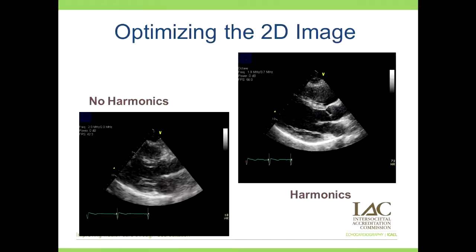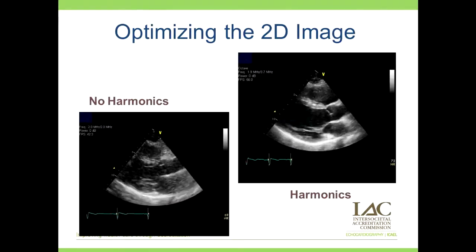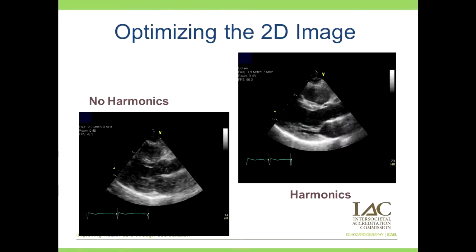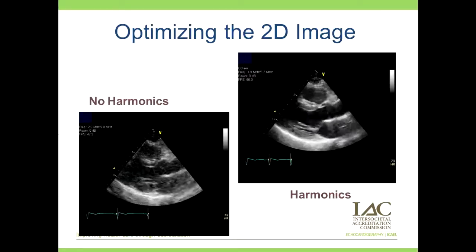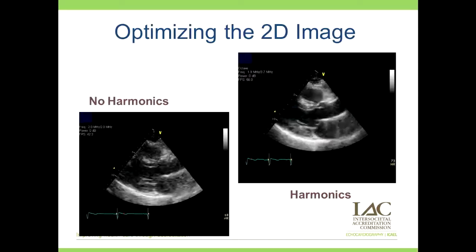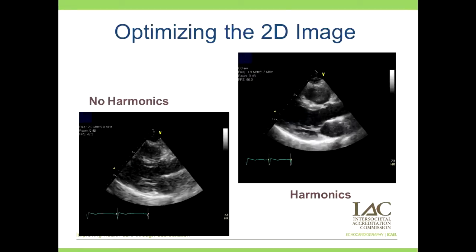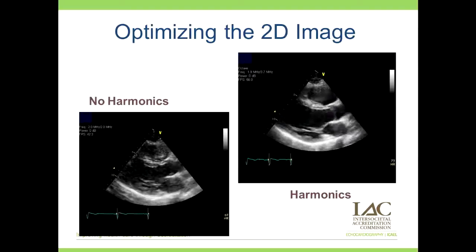Let's start by optimizing the 2D image. We know harmonics has been around in the ECHO lab for some time and we utilize it on a daily basis. Notice the image on the left compared to the harmonics image on the right — the difference in image quality, resolution, and how harmonics brings out better endocardial definition on our echocardiograms. This is one thing we do on a daily basis to help optimize our 2D image.